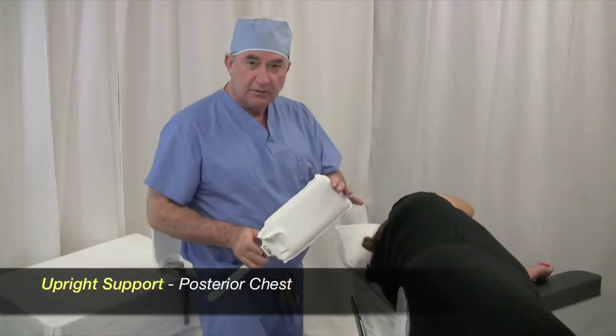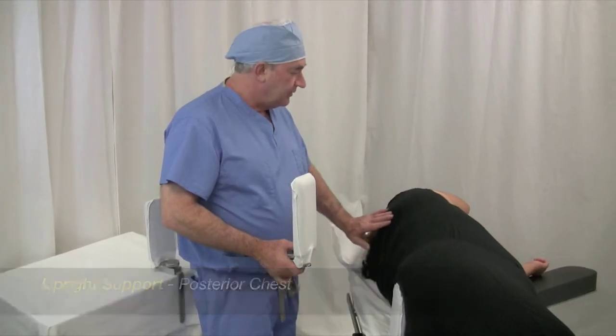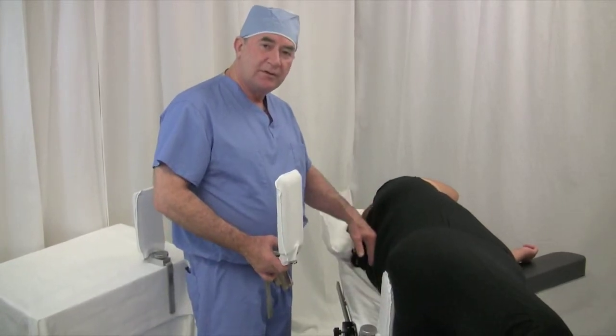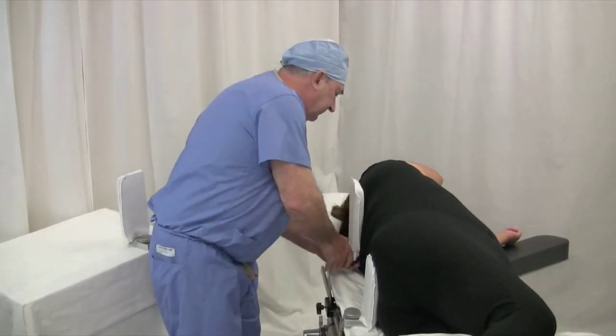I then use a large upright for the posterior chest. Place it just below the apex of the scapular bones so that you support on the chest, not on the scapulae.